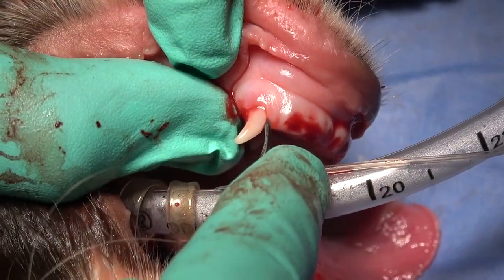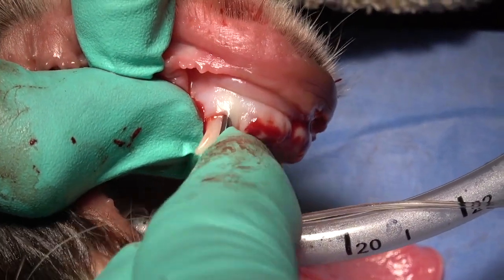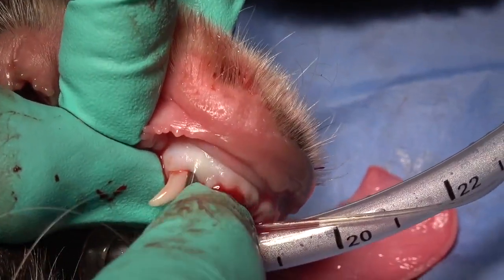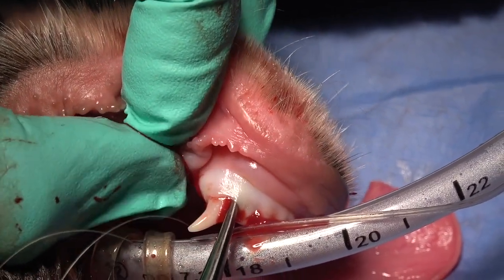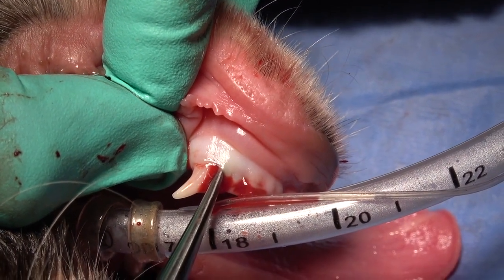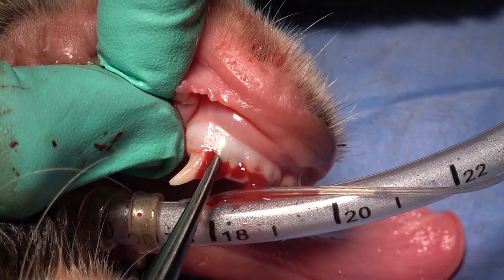As we proceed to the mesial aspect, we're going to use a concave luxating elevator, placed in the space between the bone and the tooth. We're using that in a torqued manner, torquing it toward us or torquing it caudal, holding that for 15 seconds and putting a slight increase in pressure on the luxator as we twist it.